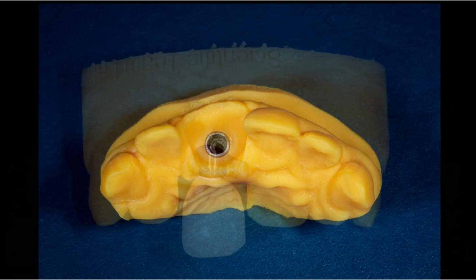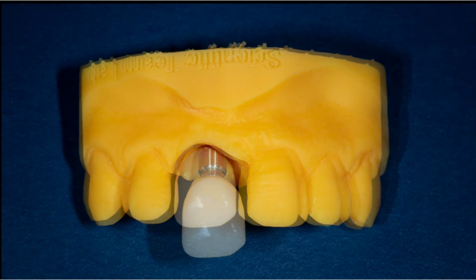Here is the digital lab analog in a 3D printed cast and the final delivery to the patient.